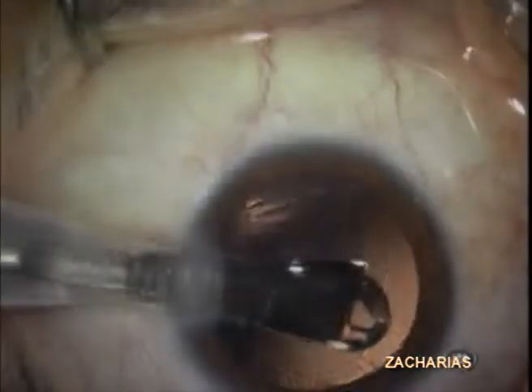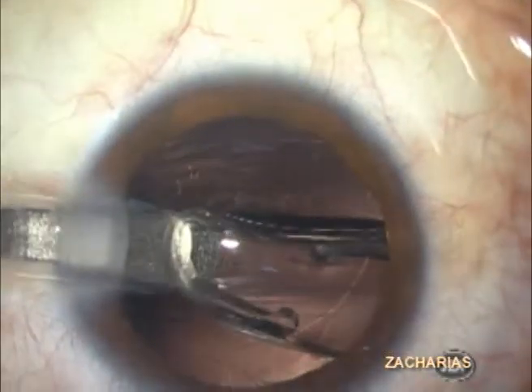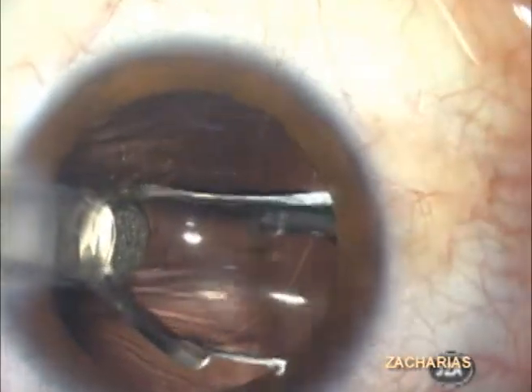On another aspect, the current interest in refractive lens exchange and the new developments in IOL technology have stressed the issue of capsule integrity. A ruptured capsule increases complications and may totally prevent the use of the intended IOL, frustrating the patient and the surgeon.